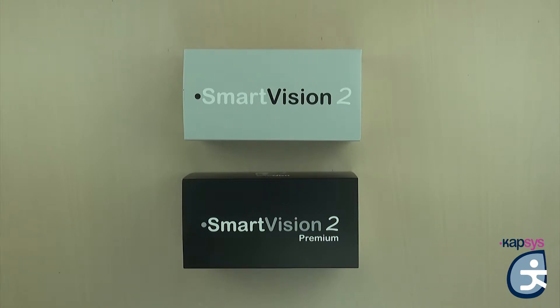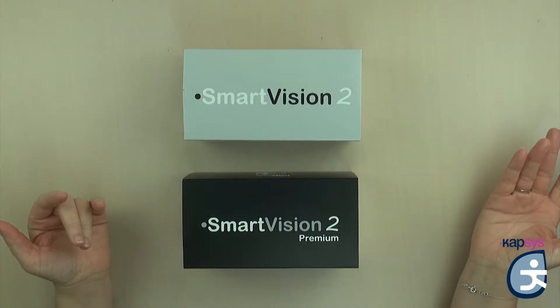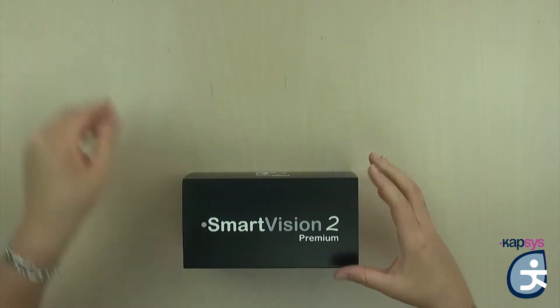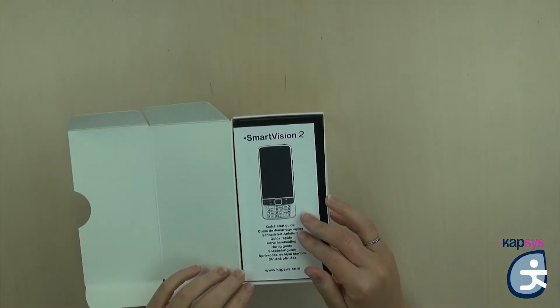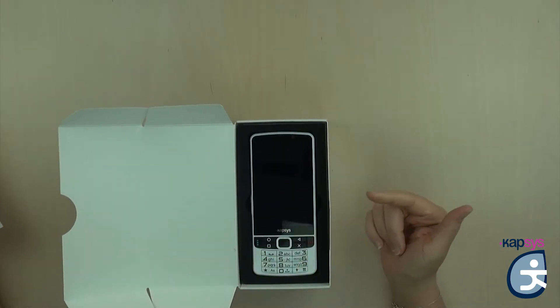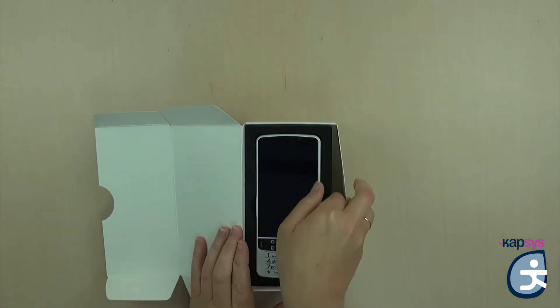We will start with the content of the box. The Smart Vision 2 and Smart Vision 2 Premium boxes contain the same elements. We will open the Smart Vision 2 Premium box. Slide the sleeve to the side and you will have the content of the box. First, you'll find the quick starting guide explaining the basics. Then you have the foam — we will come back to it a little later.